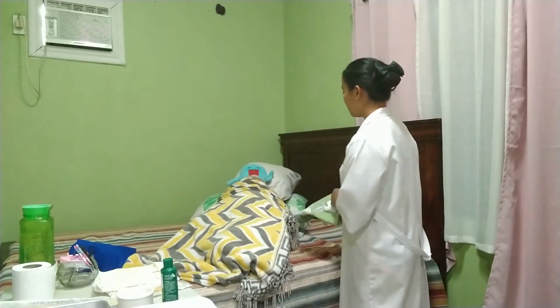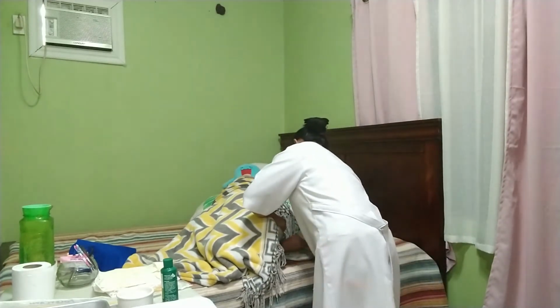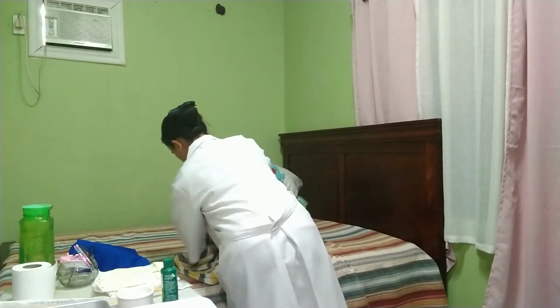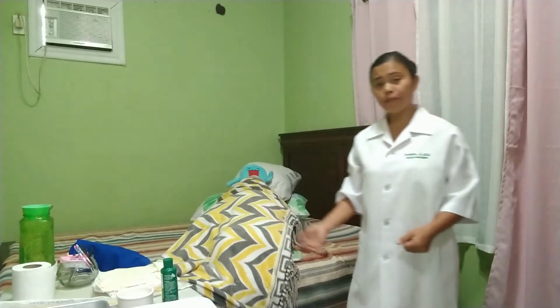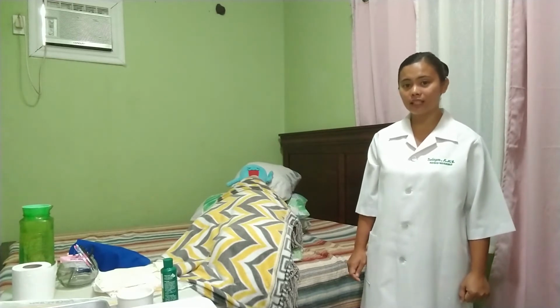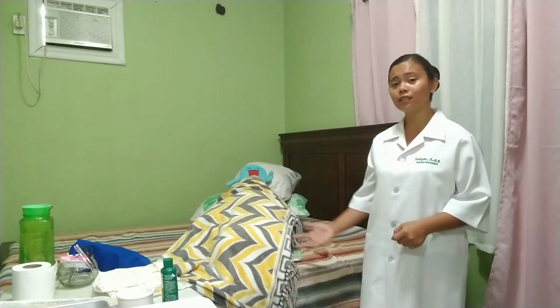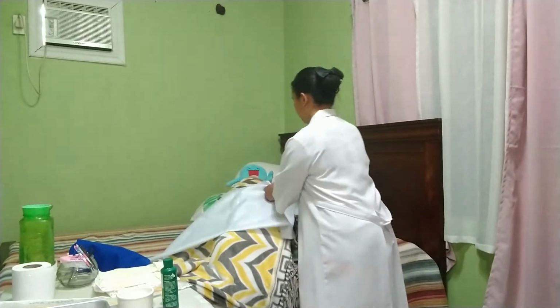Miss Angelina, I'm going to place the waterproof pad underneath you, okay? Alright, here we go. Now that we have placed our waterproof pad, the next thing to do is to drape our patient. Now, the draping technique, as we previously mentioned in our video, the technique that we will be using here is the diamond technique, which will allow the most privacy, and also the client could rest on the blanket.